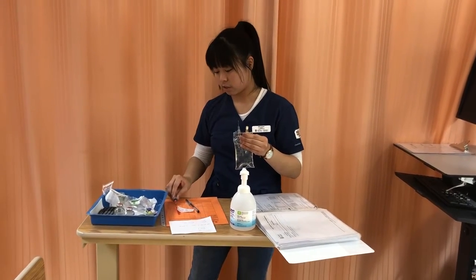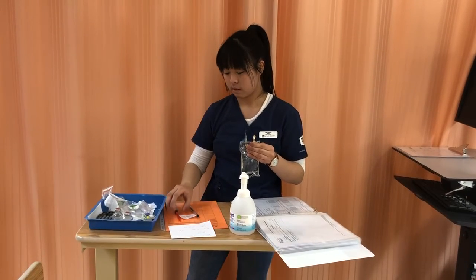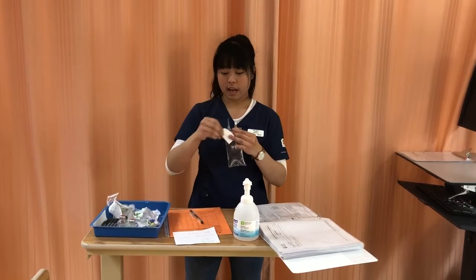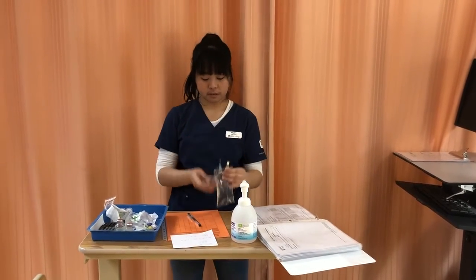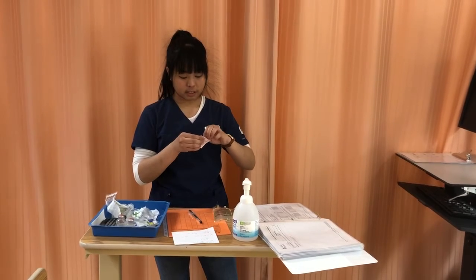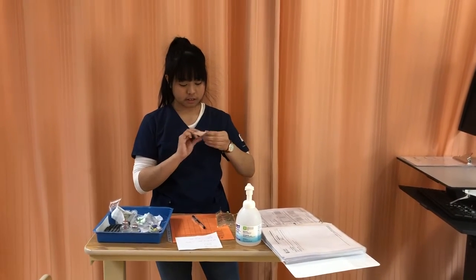This can go straight into the sharps container. And I'm just gonna recap it like so. That goes to the sharps. And I have my label here. I'm just gonna put it aside. And I will be putting it here.